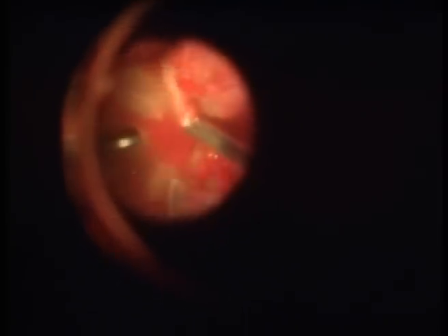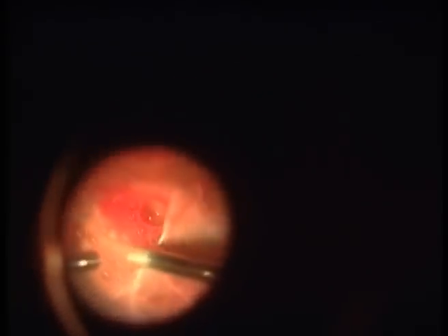Care is taken to relieve all traction around the tear and to achieve hemostasis. The peripheral condensed posterior hyaloid phase is excised and the retina is flattened mechanically by injection of perfluorocarbon liquid. Adequate pan-retinal laser photocoagulation and laser retinopexy followed by silicone oil tamponade completes this case, achieving all the predetermined goals of diabetic vitrectomy.